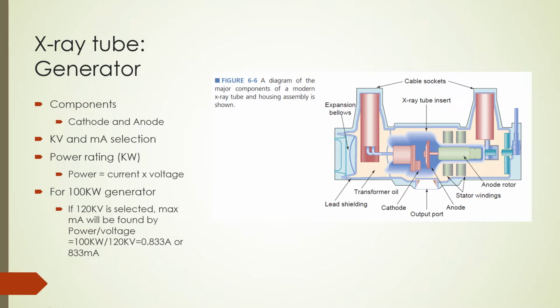Here is a question you may try. For a 100 kilowatt CT generator, if 140 kV is selected, what is the maximum allowable mA?